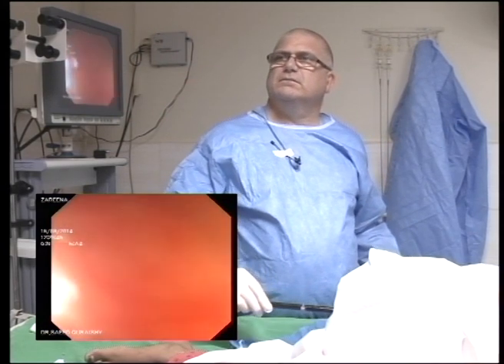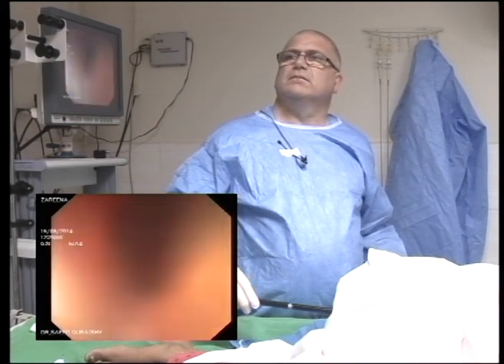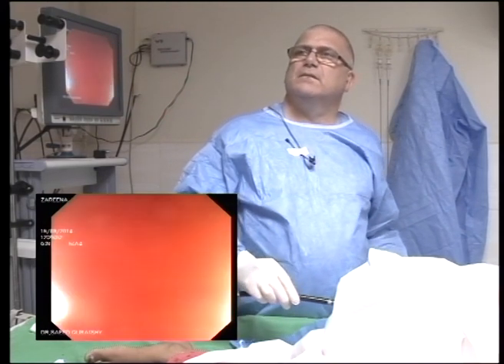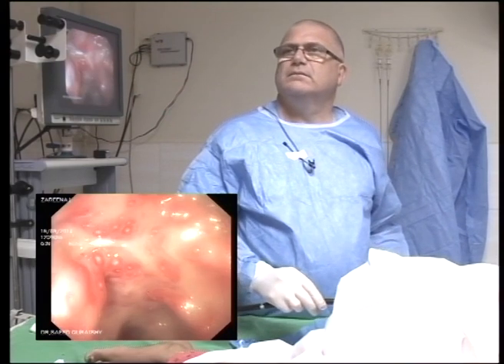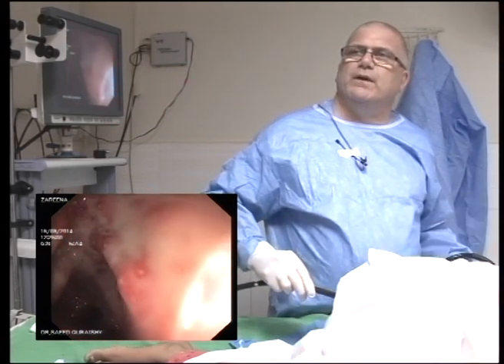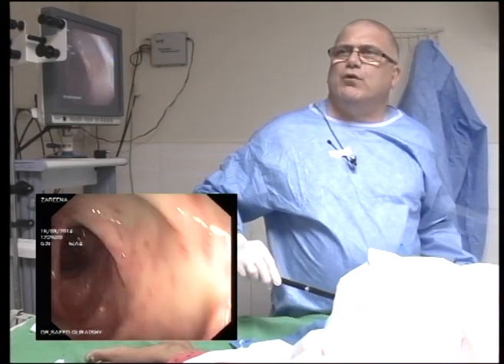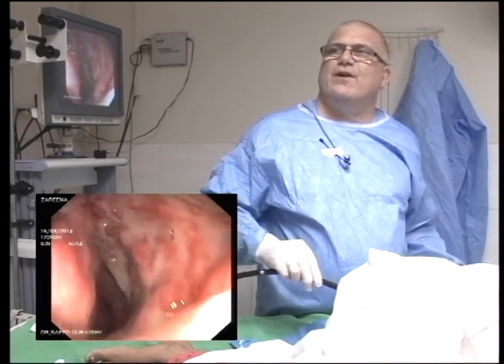Just over there, yeah. Okay. That looks very sore. It's very, very sore. So what you've got to be careful of when you get someone with this sore bowel is how much pressure you put on in there. This is not Hirschsprung's, my friend.